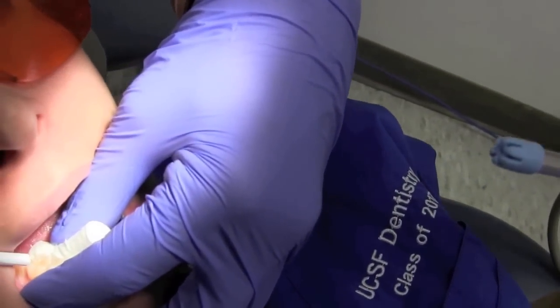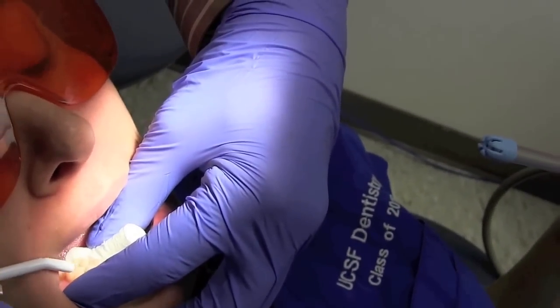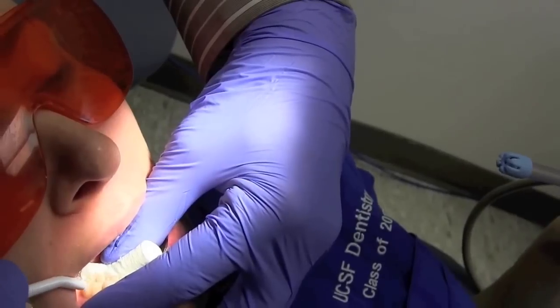Make sure that you're just getting air. Apply air until the tooth is nice and dry.